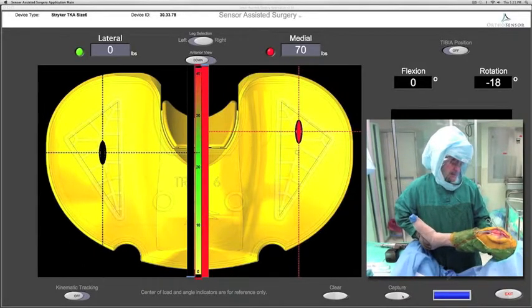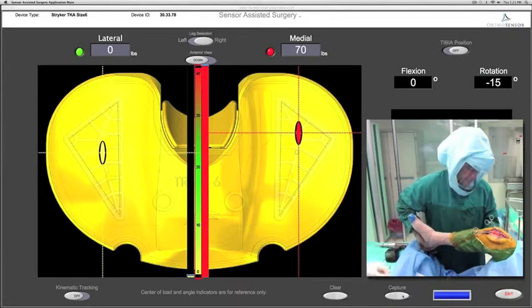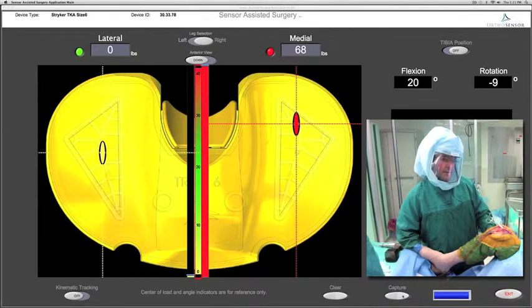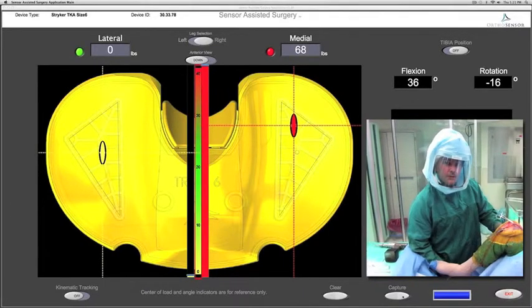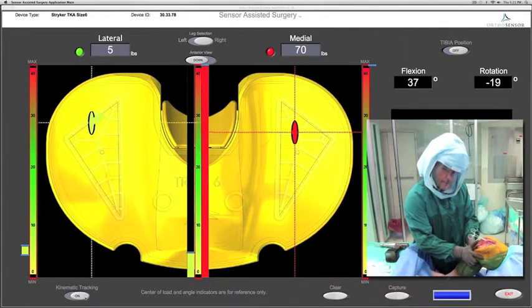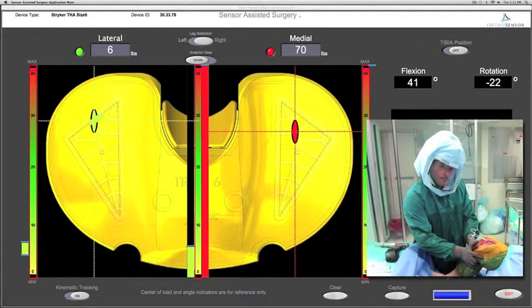As the knee is taken into extension, excessive loads medially are seen as well as in early mid-flexion. This is showing us that all medial structures are affecting the medial tension. The knee is now taken into deeper flexion and consistently excessive loads are seen on the medial compartment as compared to the lateral compartment.